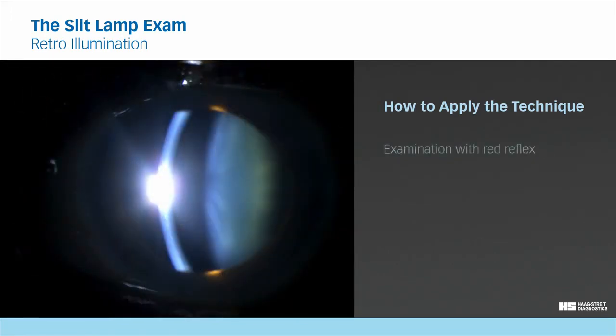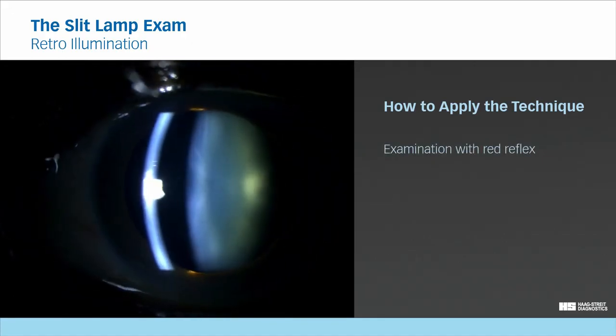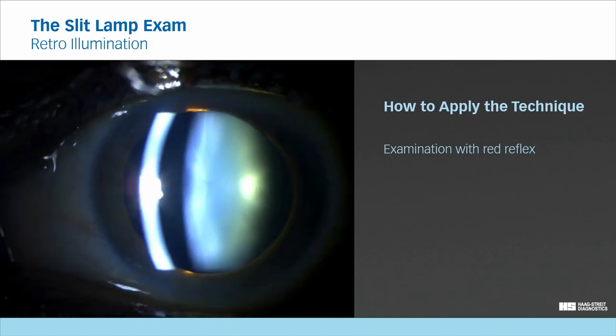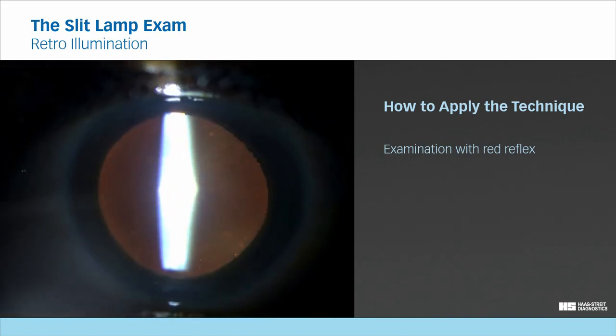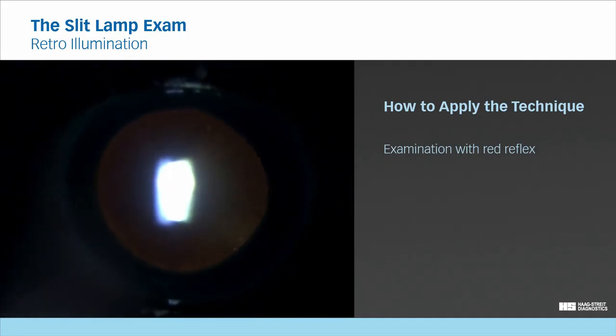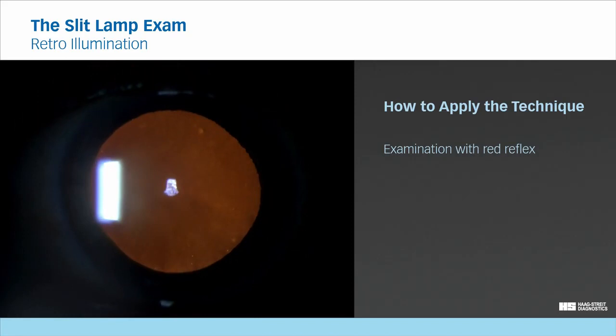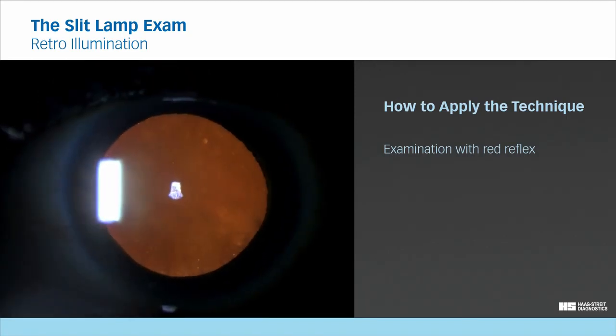To use the red reflex for the examination of the lens, cornea, or iris, focus on the structure you want to examine. Then bring the illumination in an almost coaxial position with the microscope. Shorten the beam to avoid disturbing reflections from the iris. You can move the reflections out of the field of interest again by decentering the light beam.